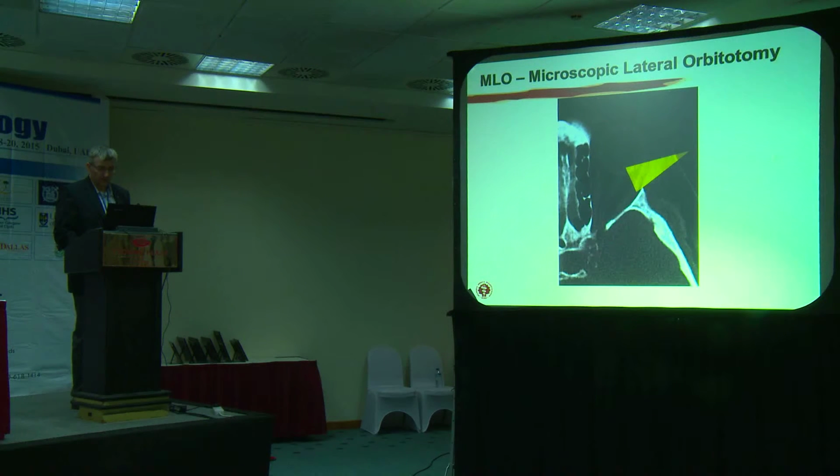The neurosurgical microscopic approach is a craniotomy approach. As you can see here, this entire bone is removed during microscopy to facilitate visualization with the microscope. So this bone along the rim of the orbit is removed during such surgery.